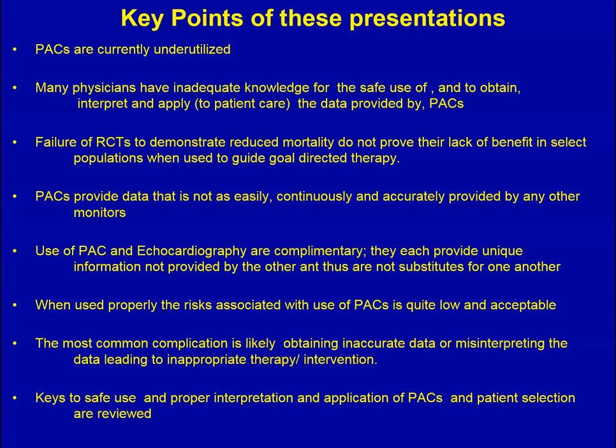The key points are that, in my opinion, pulmonary artery catheters are currently underutilized. Many physicians have inadequate knowledge. The failure of randomized controlled studies to demonstrate that they reduce mortality does not prove their lack of benefit. Pulmonary artery catheters provide data that is not as easily or continuously or accurately provided by other monitors. The use of PA catheters and echocardiography are complementary. They each provide unique information not provided by the other, and thus are not a substitute for one another.